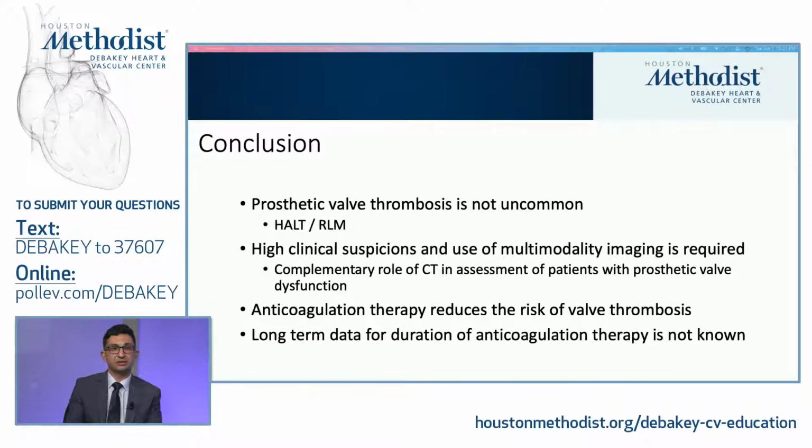There's the importance of clinical suspicion, and the use of multimodality imaging is required. There is the complementary role of CT imaging in assessment of patients with prosthetic valves. Anticoagulation therapy reduced the risk of valve thrombosis, and unfortunately we do not have long-term data to recommend ongoing anticoagulation in this patient population.